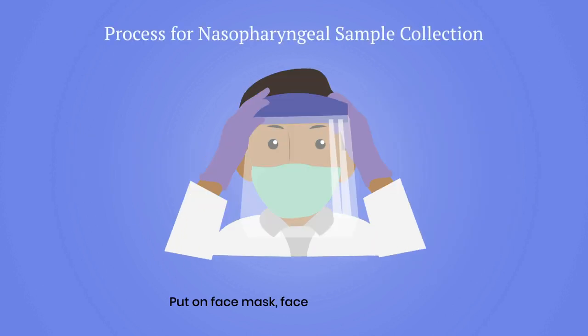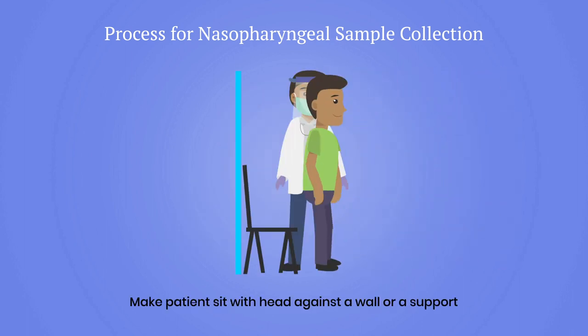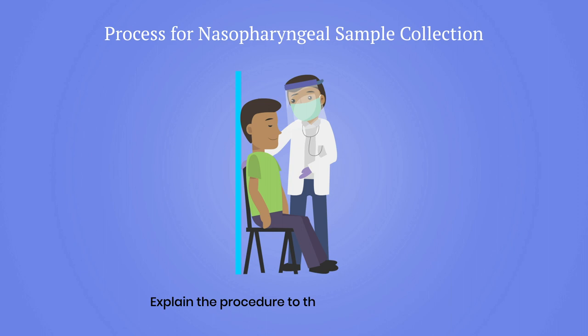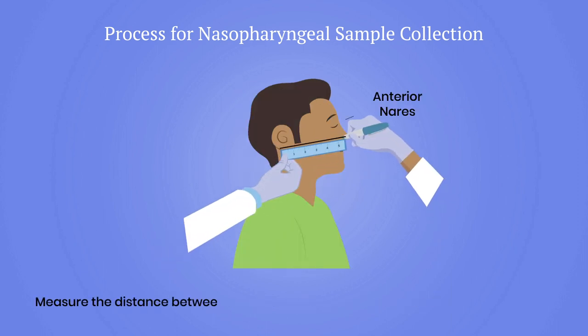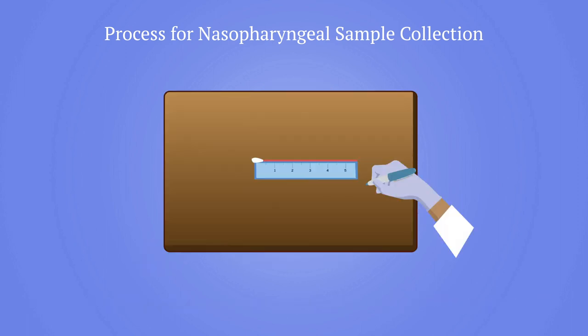Now we are ready to collect the sample. Put on face mask, face shield and gloves. Have the patient sit with head against a wall or support, as patients have a tendency to pull away during this procedure. Explain the procedure to the parents or patient. Measure the distance between the anterior nares to the lower lobe of the ear on one side using the paper scale.